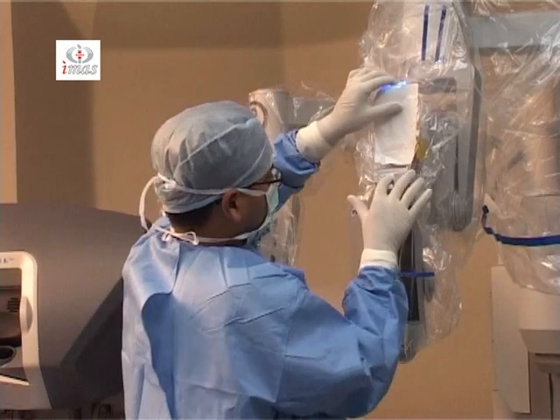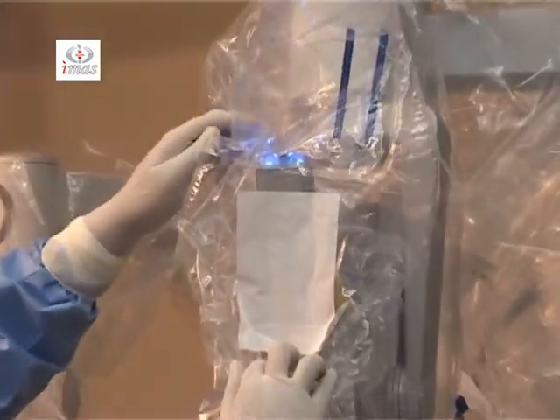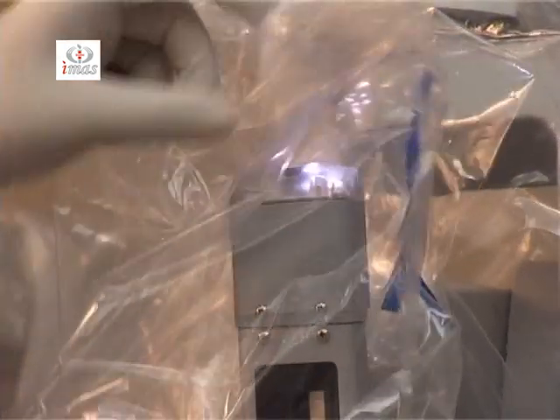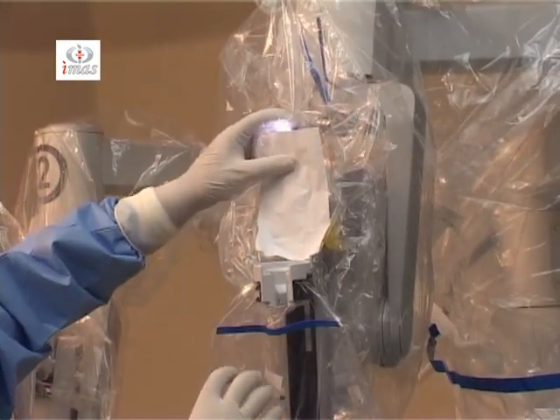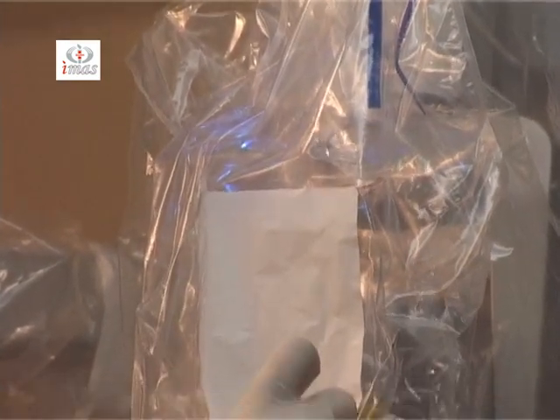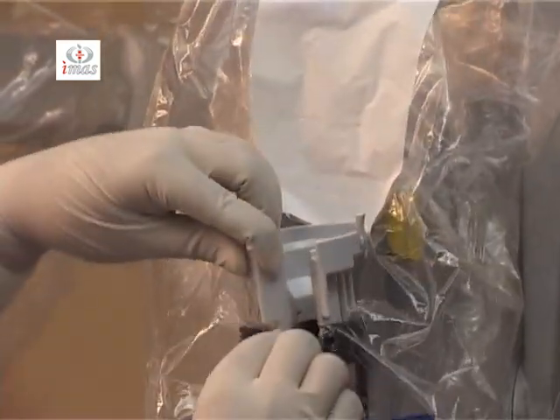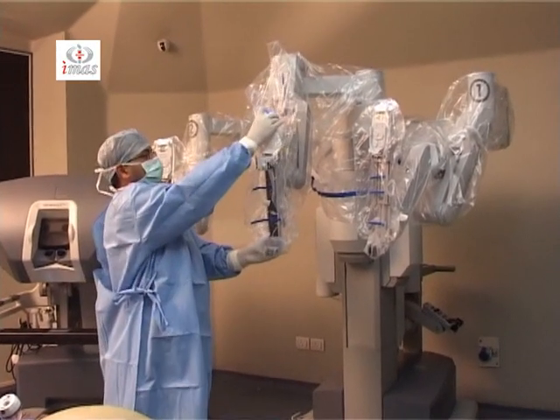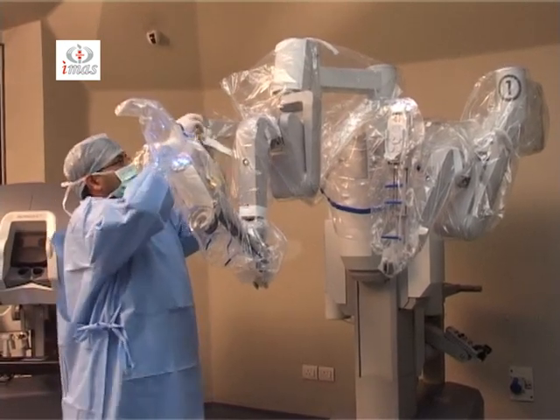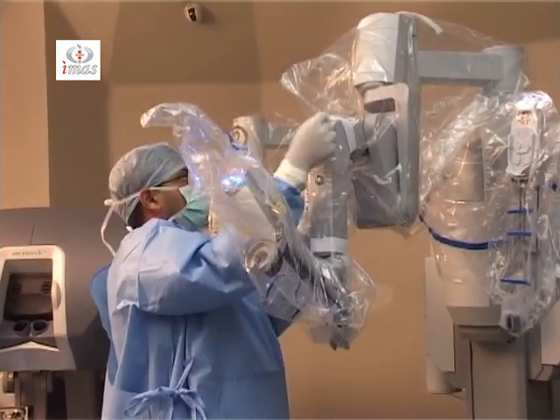And this has to be checked by pushing it down. This should be able to come down properly and then should come back on its own. Same way the third arm is also there. And you again put up these straps across just to secure the drape.